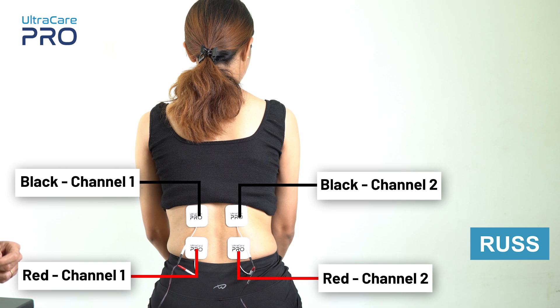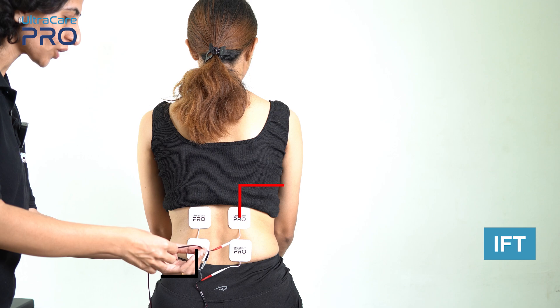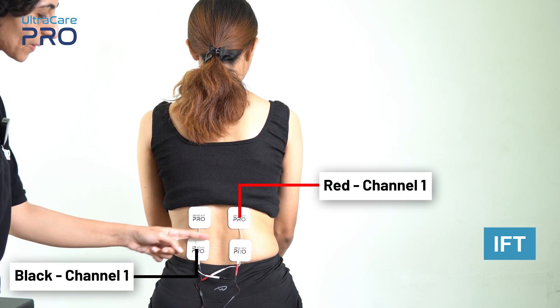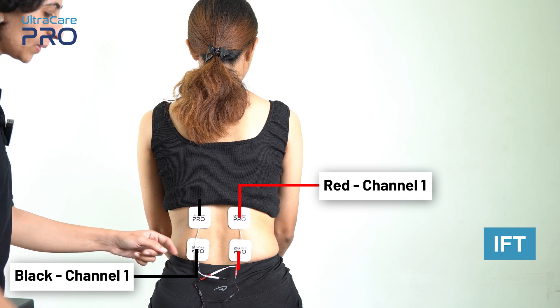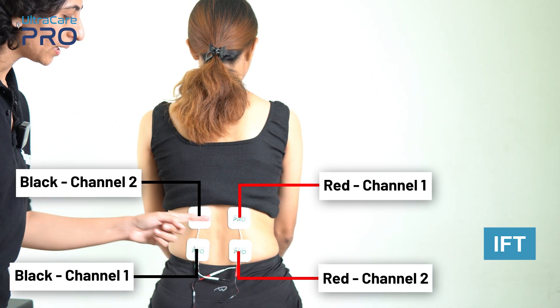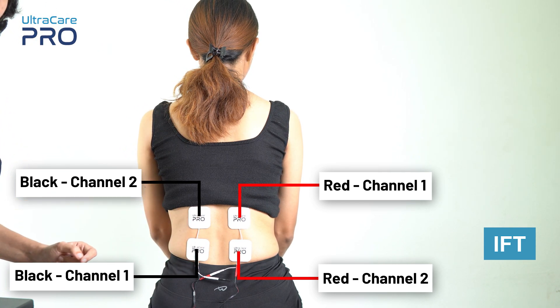For IFT application, place the red and black wire from channel 1 diagonally opposite to each other to make a cross pattern. Similarly, place the red and black electrode from channel 2 diagonally opposite to each other to make a cross pattern. Remember not to place electrodes on the center of the spine.